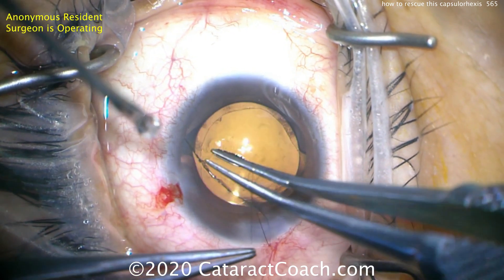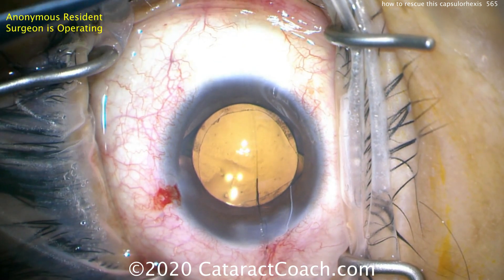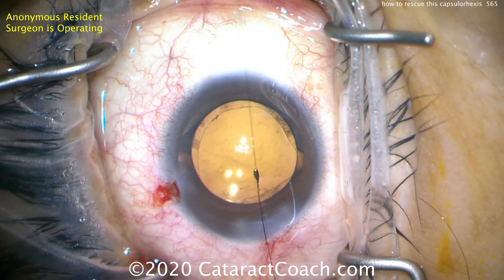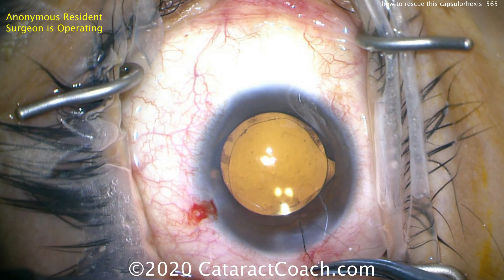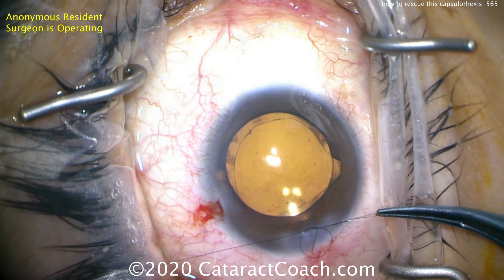Here's what it looks like — it will be pretty secure. You can see the two areas where it went out; it's not overlapping the optic fully in those two spots, but that should be of no consequence. This patient will heal up just fine, and the resident has learned an important lesson — how to rescue the capsulorrhexis, and also the reason why it kept running out.